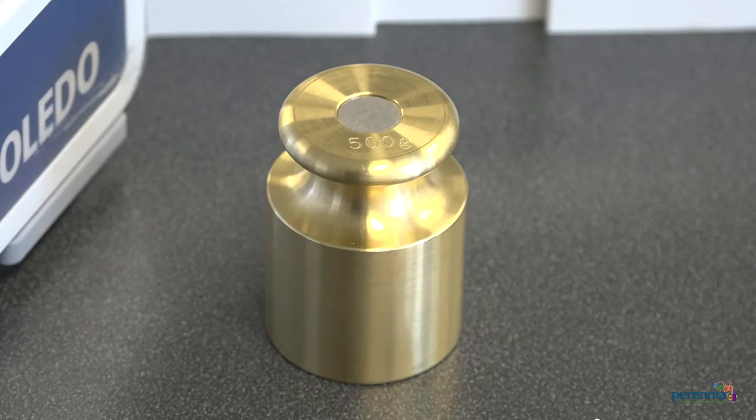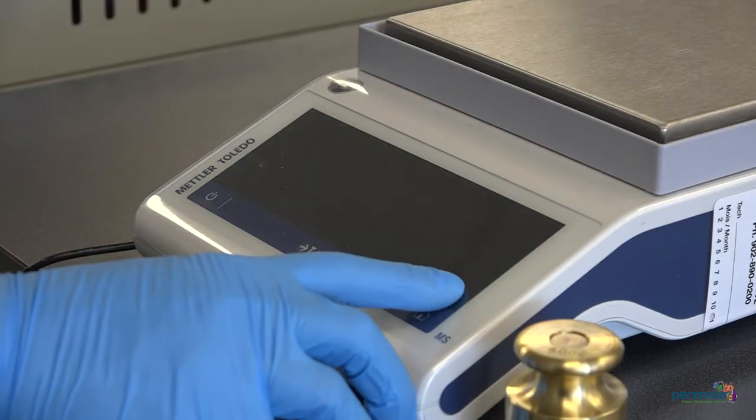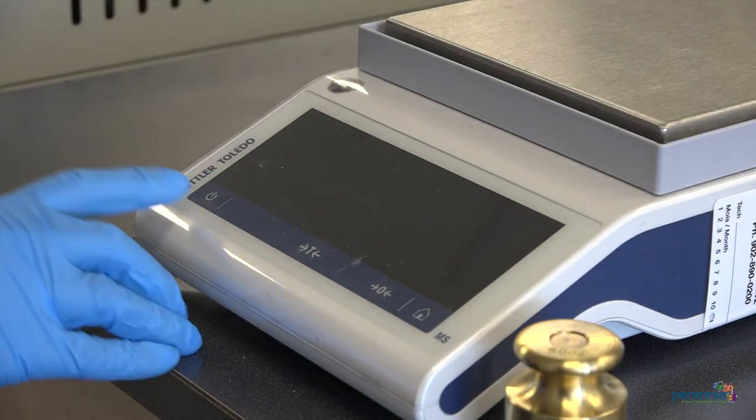The first thing we are going to do is grab our certified known test weight. Step 1: power down the scale and power it back up.